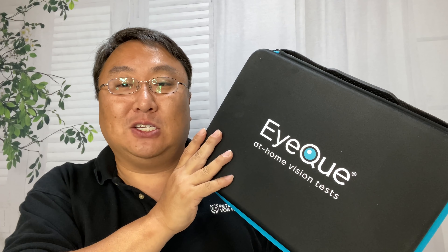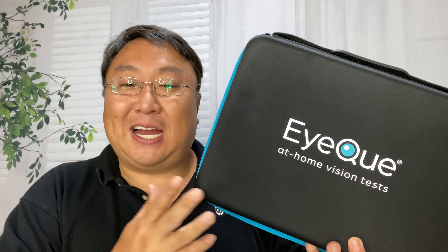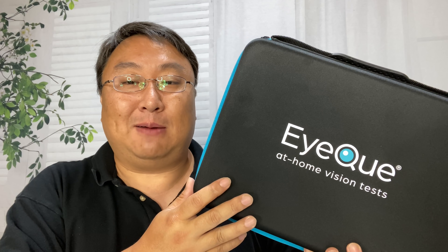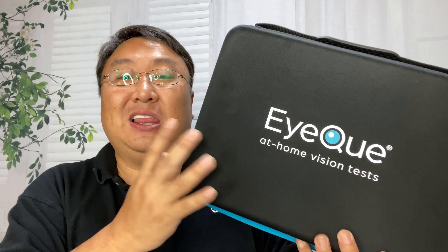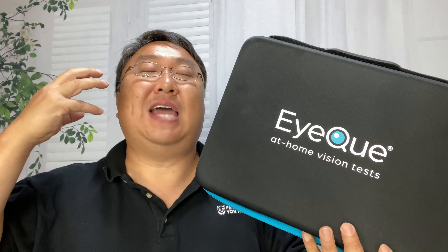I reached out to the people there and they were awesome enough to provide me with this full kit so that I could share it with you. I really appreciate that, because without something like this, for a lot of people — maybe you're sheltered at home, maybe it's just not easy for you to get out, maybe you live in an area without easy access to an optometrist, or maybe you're traveling or living abroad — a package like this allows you to constantly have the right prescription.